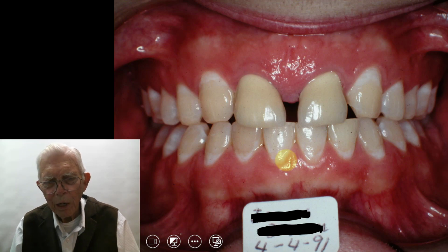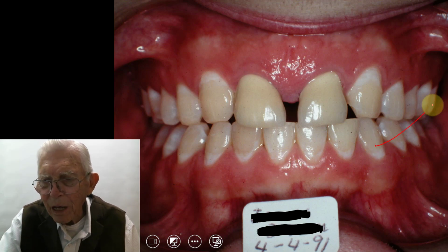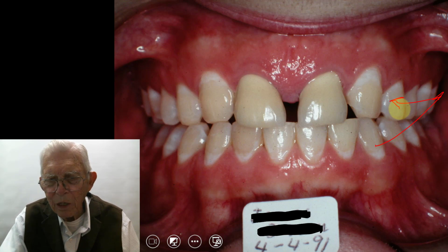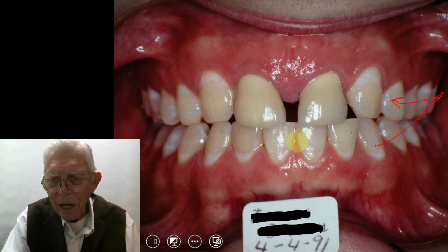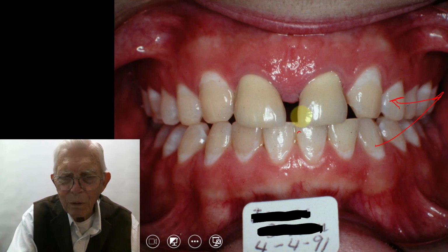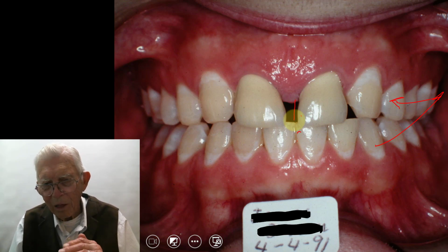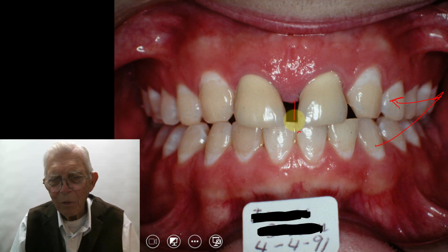You might could go in and crown all 4 teeth up there and make it match up a little better. But anyway, he was happy with it, and so as far as I know, we left him with this diastema up here, which I would like to get closed. If we did, we'd have to come in with some class 3 elastics up here and pull these teeth forward, or we'd have to strip the teeth down here on the bottom and slide these teeth together, and then get some space to close that up here. So it didn't work out just perfect, but it did pretty good.